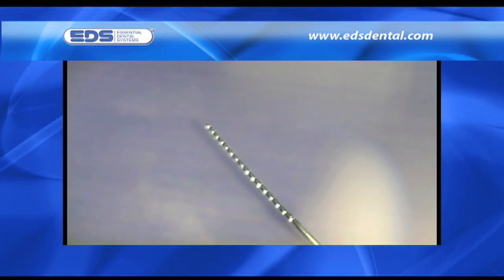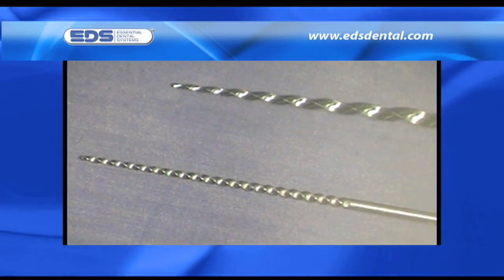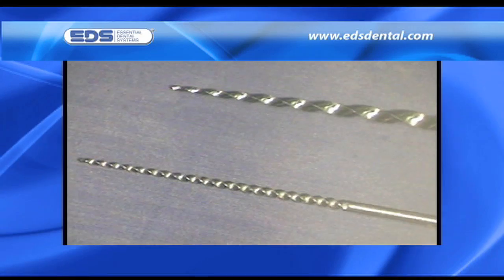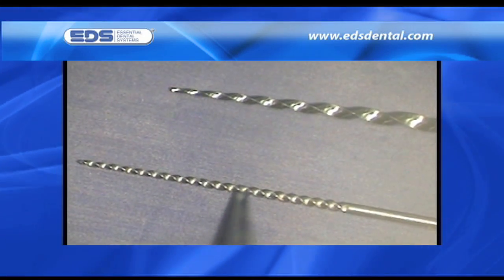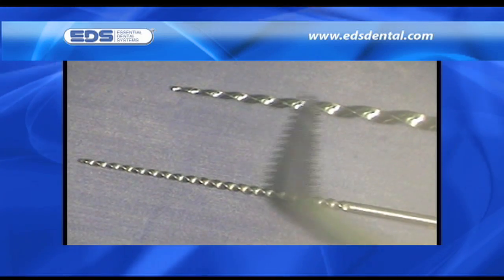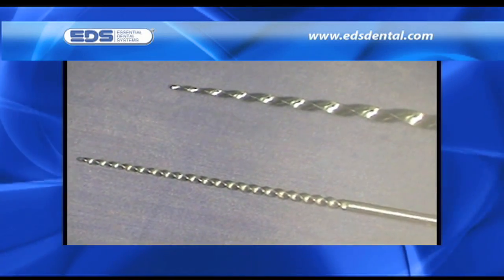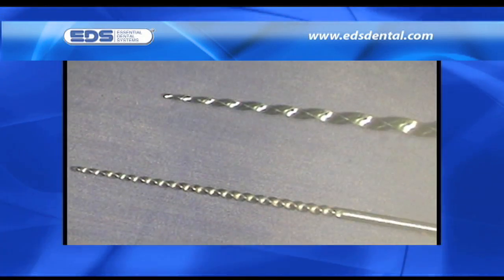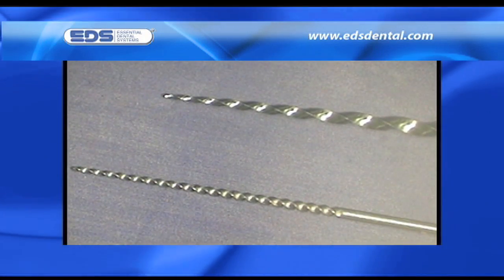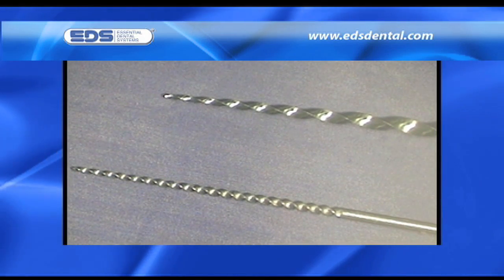Understanding this most basic of concepts is critical in understanding if the instruments you are being asked to use are rational in design and function. Knowing what we know now, we can state categorically that the flutes on another reciprocating system are designed wrongly. Note the flutes' horizontal orientation — these flutes will engage and disengage, but not cut nearly as effectively and efficiently as the more vertically oriented flutes of a relieved rima.